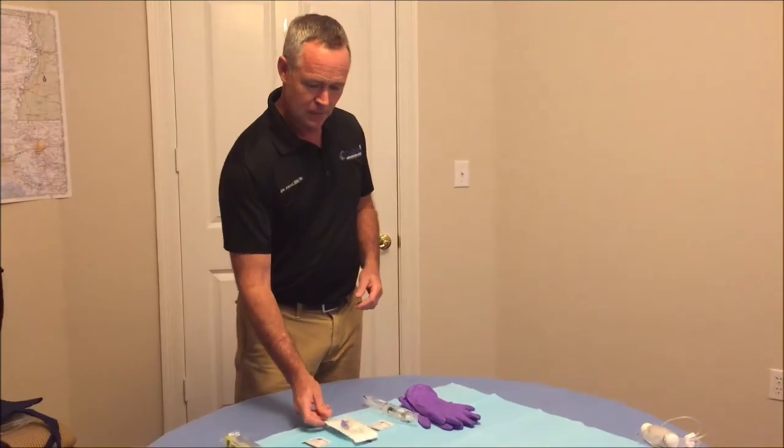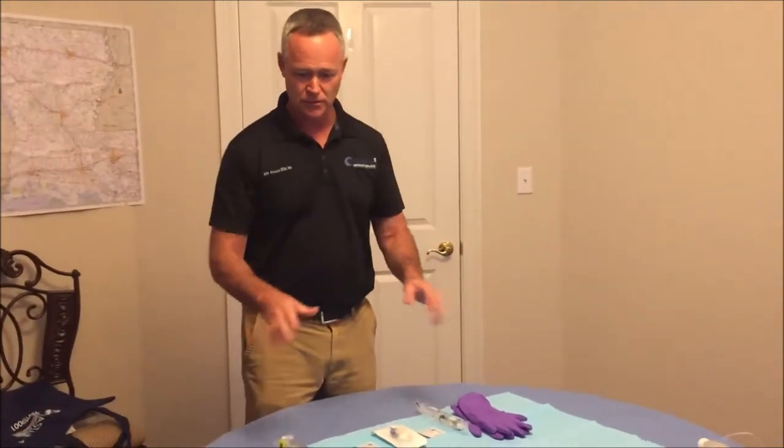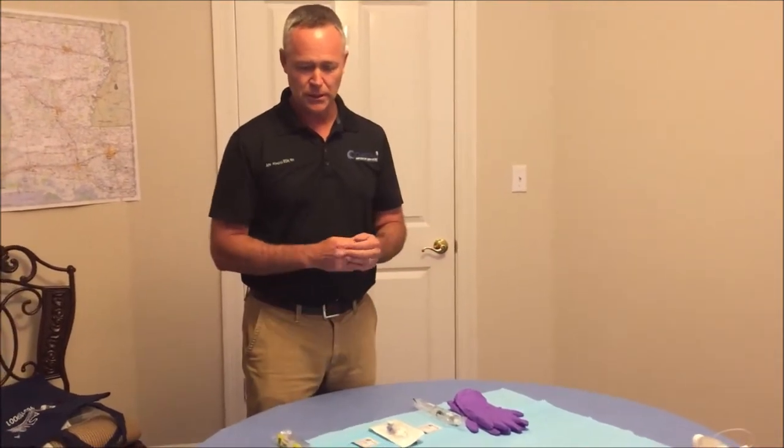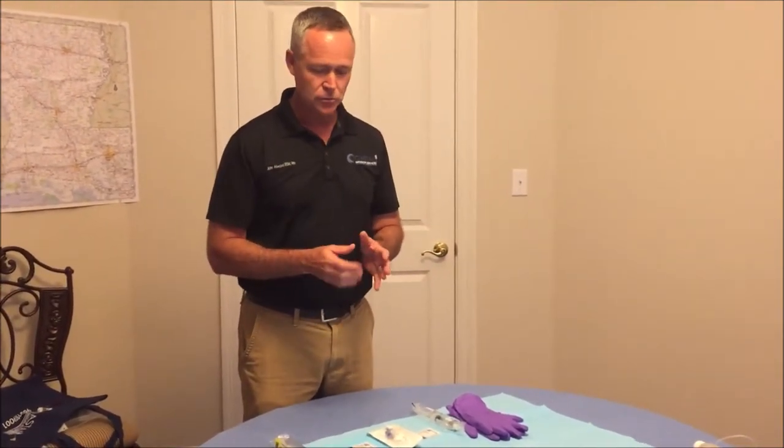So let's get started. The first thing we want to do is create a clean surface, which you can use a table or countertop — just wipe it down with any sort of antibacterial cleaner or warm soapy water.